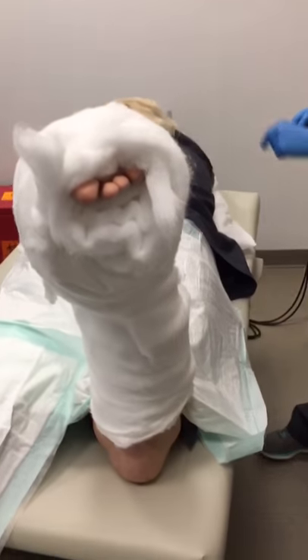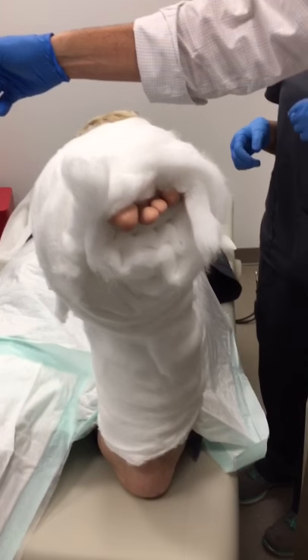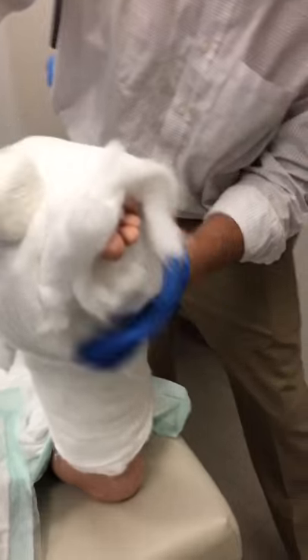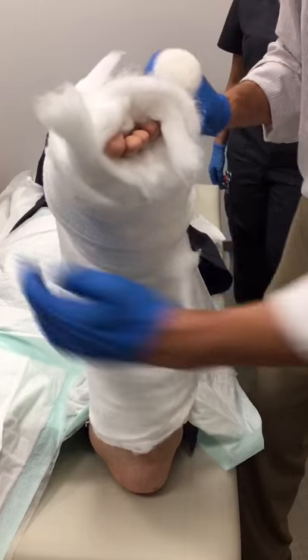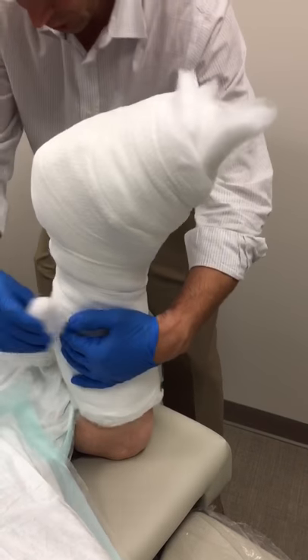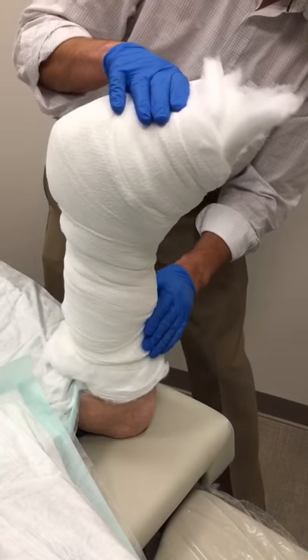Next is going to be a 4 inch Curlex to achieve compression. So here we're going to do our compressive wrap — this should be snug, should feel like it's pulling and indenting the bulky Jones dressing some. This is achieving the majority of the compression, and I'm leaving a sleeve of the bulky Jones dressing around it so that we don't damage the skin.